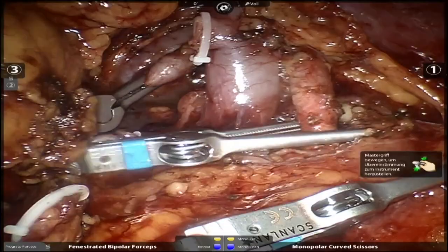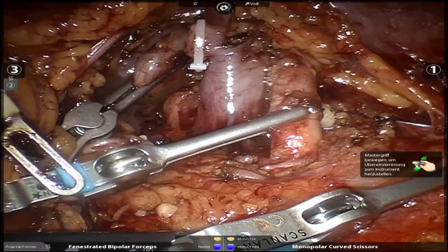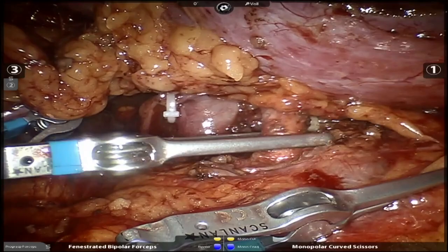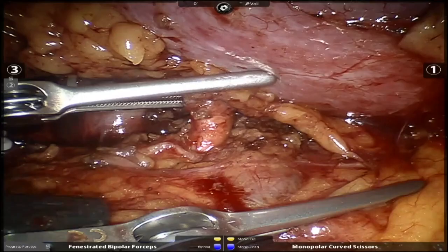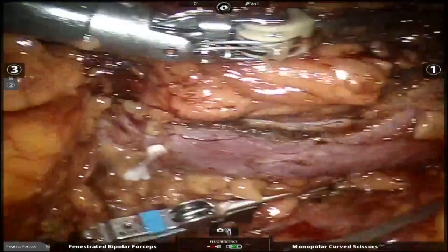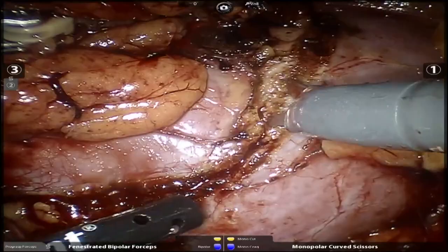In. We're going to push beyond there, maybe. No, that's not what we want. Go on in there, Brandon. Push in there. There we go. All right, let's go with that. We're going to go without the vein first and just see what we got. Turn the pneumo up, please, a little bit.